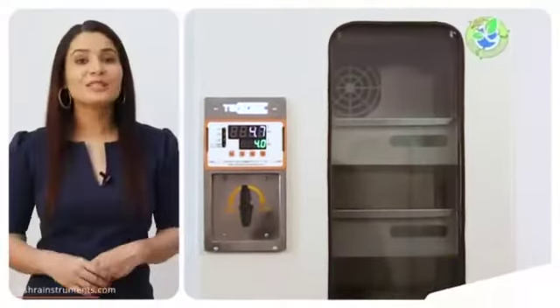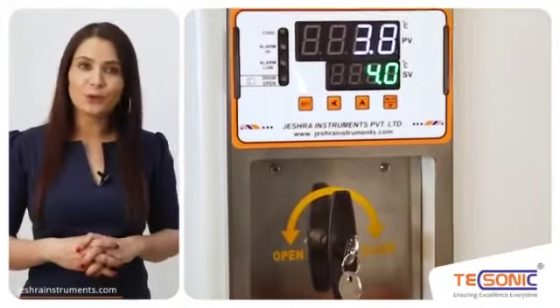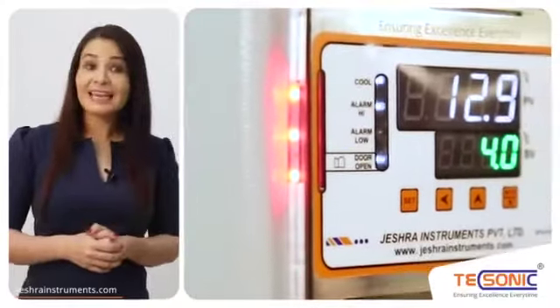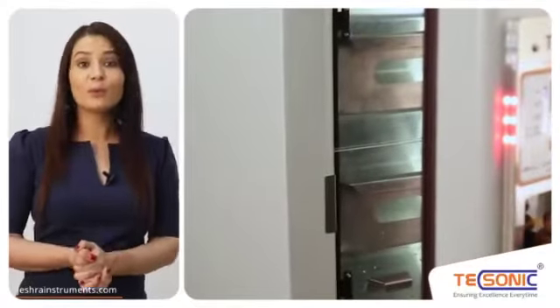This instrument's outer body is made of heavy gauge mild steel, dually powder coated, with stainless steel 304 inner chamber. This refrigerator has a micro controlled temperature controller with audio visual alarms in case of temperature deviation and a door open alarm in case it is left open for more than 2 minutes.